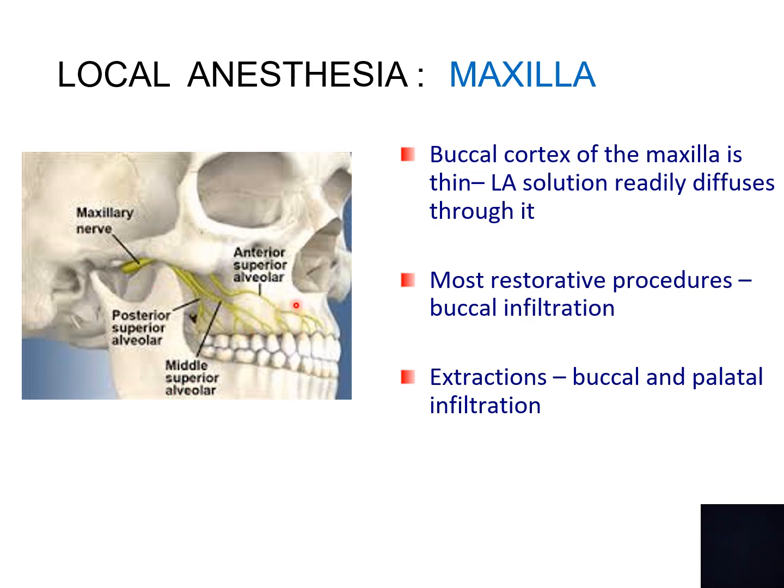As maxillary bone is quite porous, especially the buccal cortex, the LA solution is able to diffuse readily through the maxillary bone and reach the apices of the teeth. Therefore, most restorative procedures, such as fillings and root canals, can be accomplished by buccal infiltration alone, and you do not necessarily need nerve blocks in the maxilla.